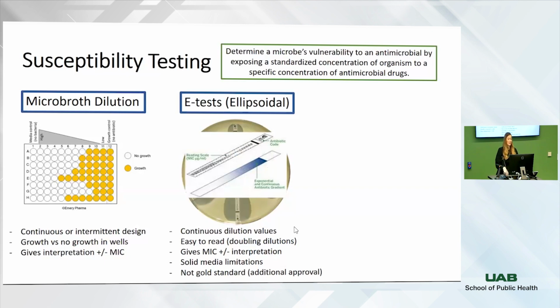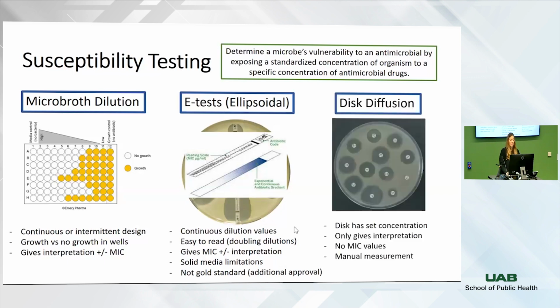There are limitations with this. Your microbroth dilution uses a liquid media. We can adjust these liquid medias to grow almost any bacteria that we want. But the E-test can only be done on solid media, which has a lot more limitations to it. And then it's not the gold standard. So while a lot of these are FDA approved tests, we still have a lot of limitations for what drugs and what bugs we can test on these. And all of these tests need additional approval.